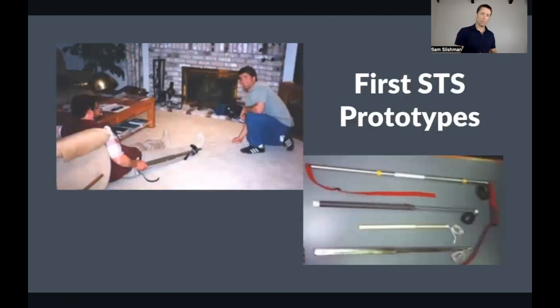All right, but moving to the history a little bit more, tried a lot of different designs and eventually made, I have it right here. So this was the STS version 1, and this is enormous. It's steel, it weighs 5 pounds, and I built it with 8-to-1 mechanical advantage. And that just shows my own perception of how much force it takes to stretch a leg.